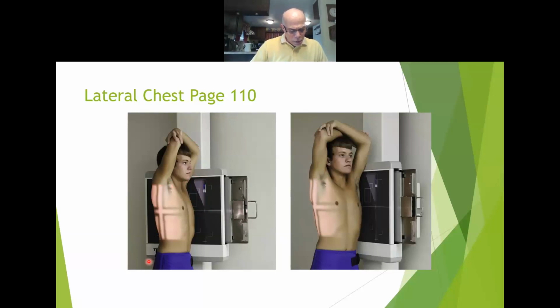So let's see where we're at. It says, once you've done that, having them flex the elbows, place an intravenous catheter stand in front of an unsteady patient. You could actually have them hold an IV pole real high. Get them to extend the arms out if they're unsteady. Some of our rooms actually have bars that they can hold. So it's just getting the shoulders up is what we're after. It's just the IR height. It's the same. It's 1.5 to 2 inches above the shoulders.